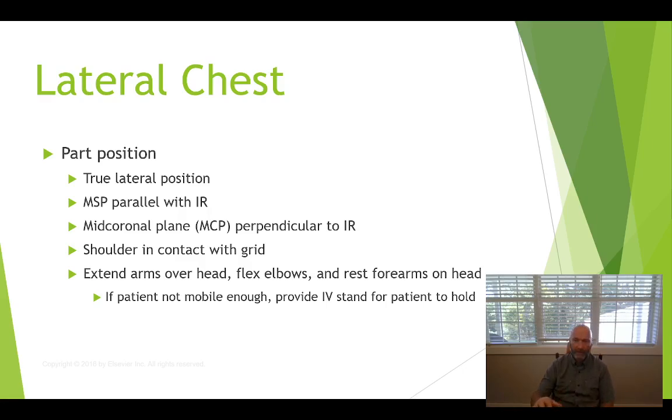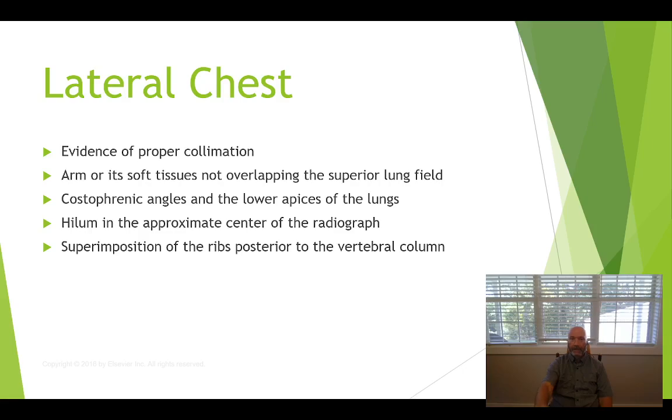You can also use an IV pole. Again, keep in mind the IV poles move, and if the patient starts leaning on the IV pole, that could be a bad day for the patient. The IV pole may get out from under them.